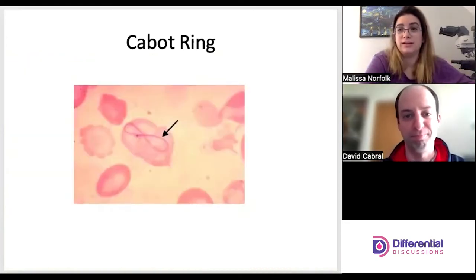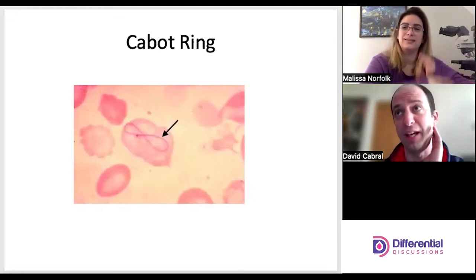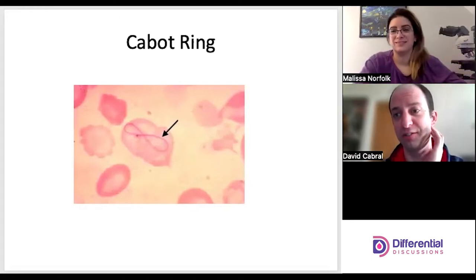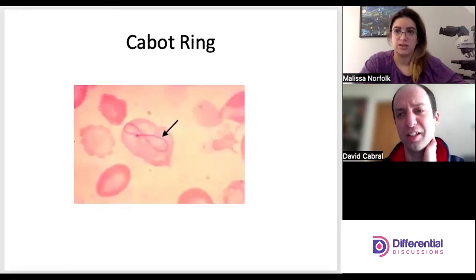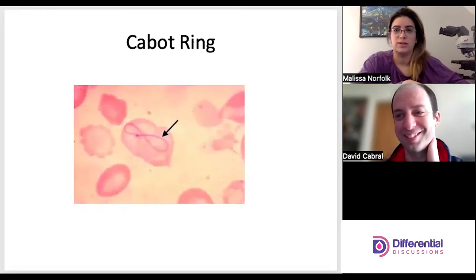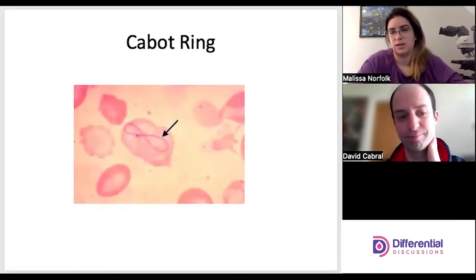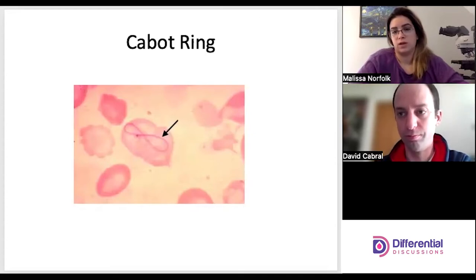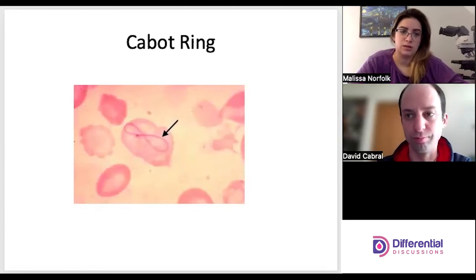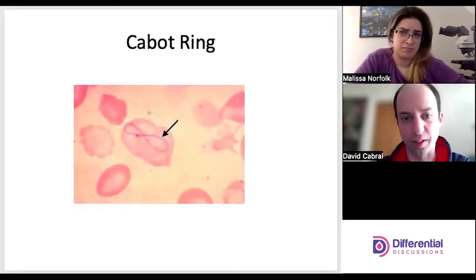Cabot rings — you don't see these very often at all. They are remnants of microtubules that were mitotic spindles and are generally associated with erythrocyte production issues. You might see them in megaloblastic anemias, occasionally lead poisoning, or MDS.